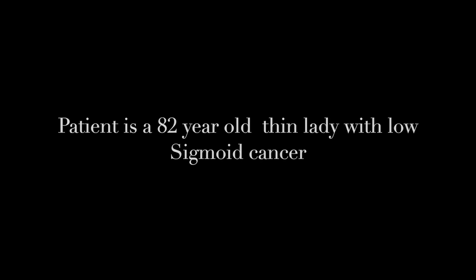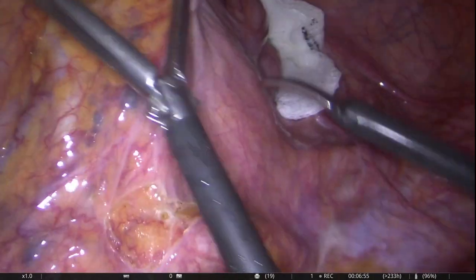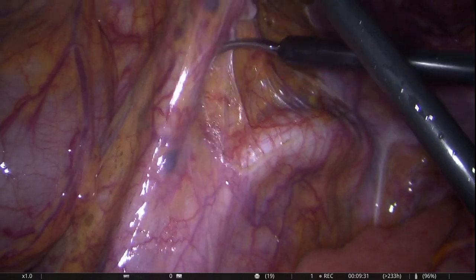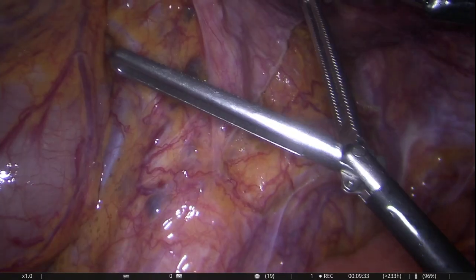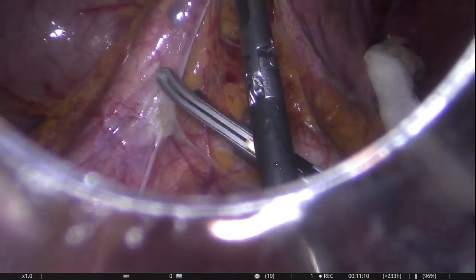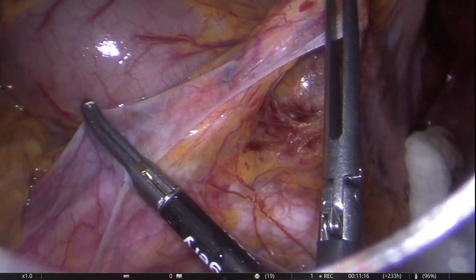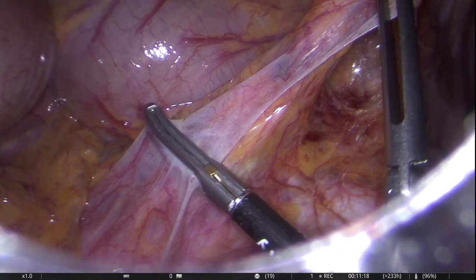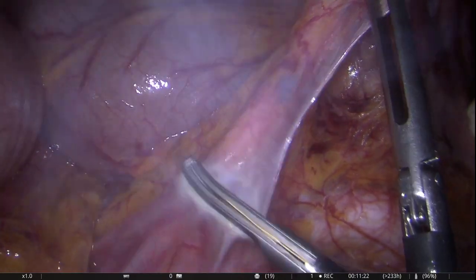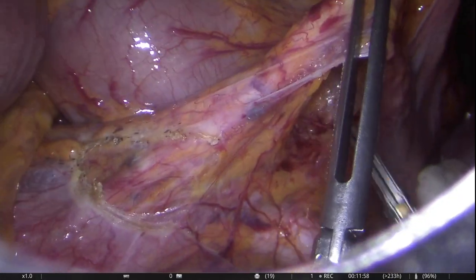Our patient is an elderly lady with a low sigmoid cancer. As usual, we start our dissection by opening up the peritoneum on the sacral promontory. Lymph nodes are seen along the course of the inferior mesenteric artery which have taken the blue dye injected to mark the tumour. We use a combination of energy devices and scissor diathermy to carry out the dissection.